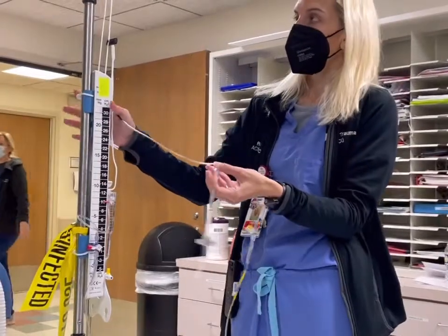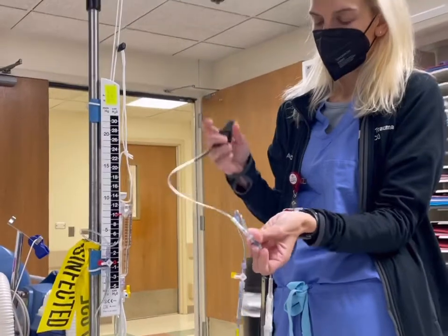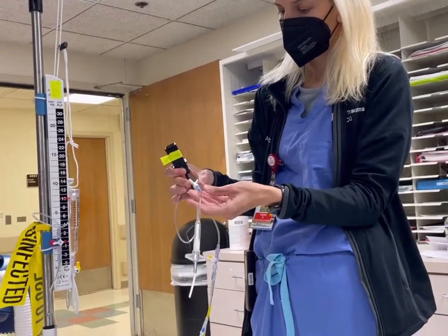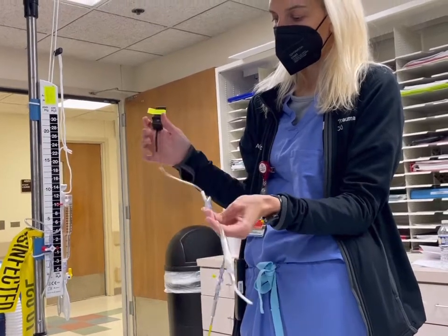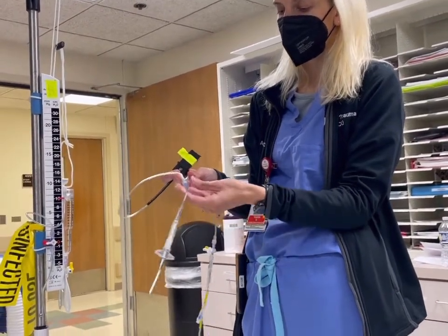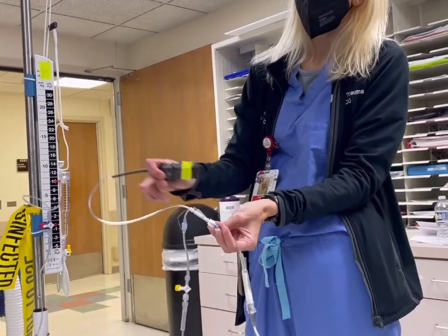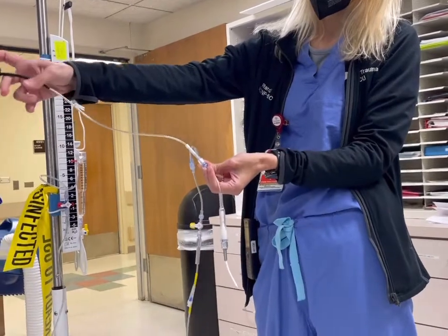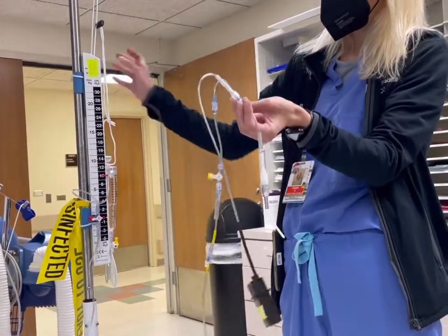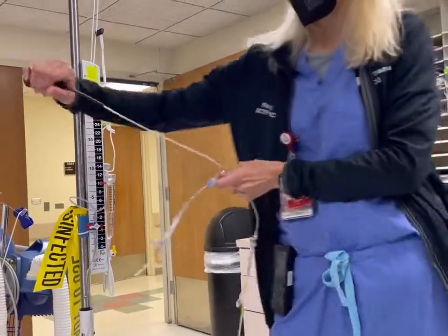Okay, guys, this is the other EVD that you'll see here in the surgical trauma ICU. This is also known as a bolt. However, this is what Dr. Schreiber likes to use as a bolt / drainage EVD system. This is the Y connector that goes to the bolt, reading the ICP, and then the actual drainage system is connected as well to it. If it's just the bolt, you won't have this drainage system.